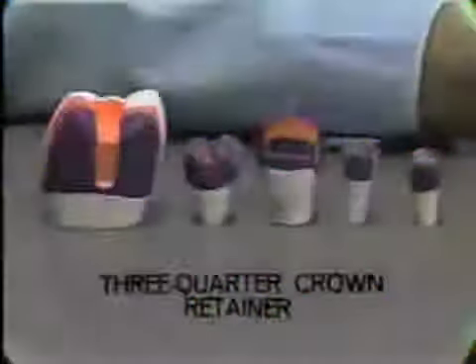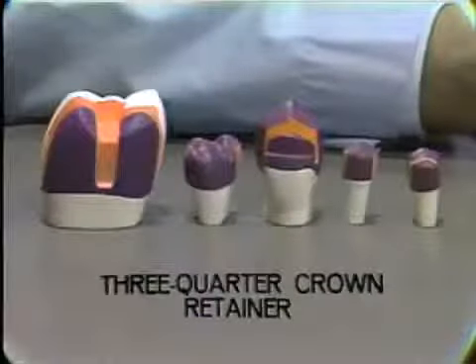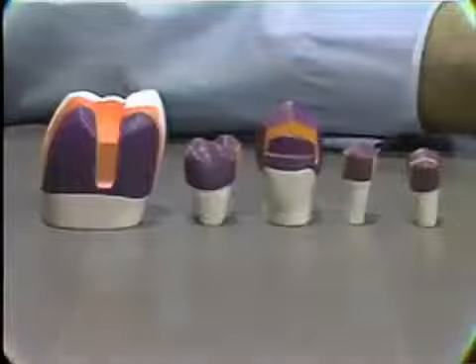As we have seen, the three-quarter crown retainer is used on both anterior and posterior teeth. At the present time it's more extensively used on posterior teeth. So let's have a look at some examples of three-quarter crowns on bicuspids and molar teeth. Here is an example of the three-quarter crown on a bicuspid tooth.